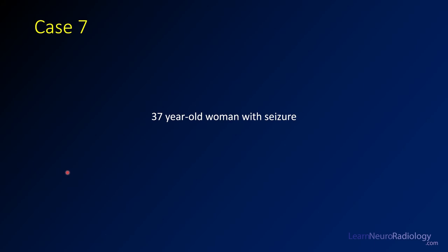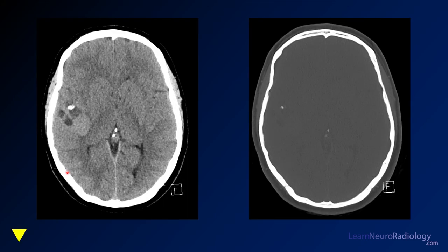Today we have a 37-year-old woman who's having seizures. What you'll find in a lot of these brain tumor patients, seizure is going to be the history provided. Here we have a couple of images from a CT — a brain window and a bone window. We're going to pause for a second as we look at these, so just focus on what you think the abnormality might be.